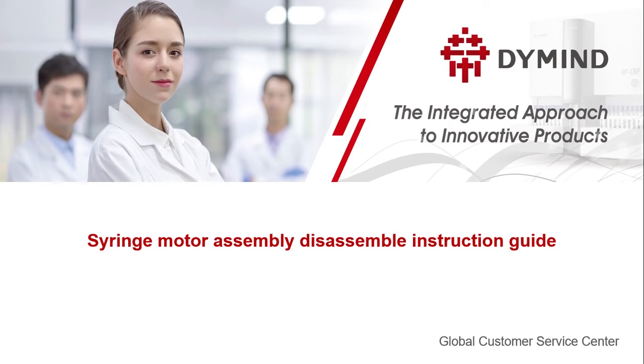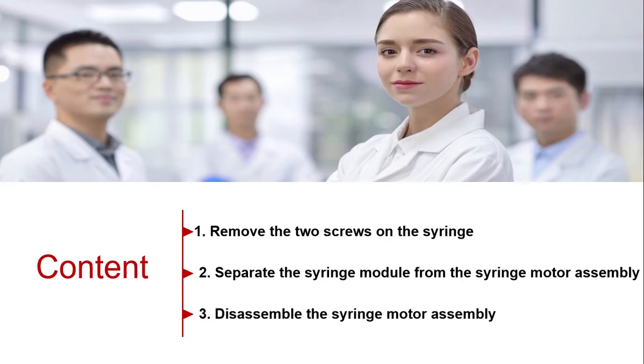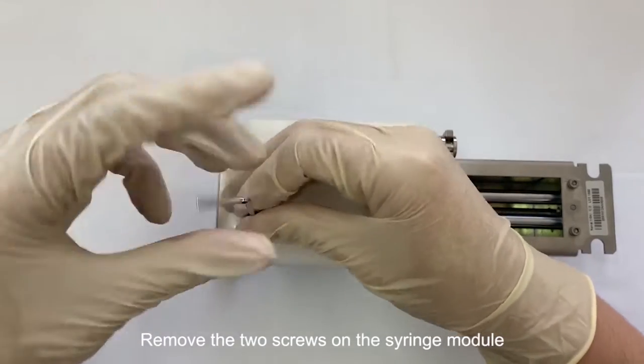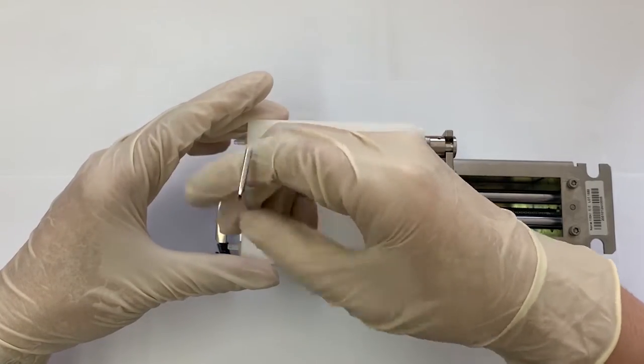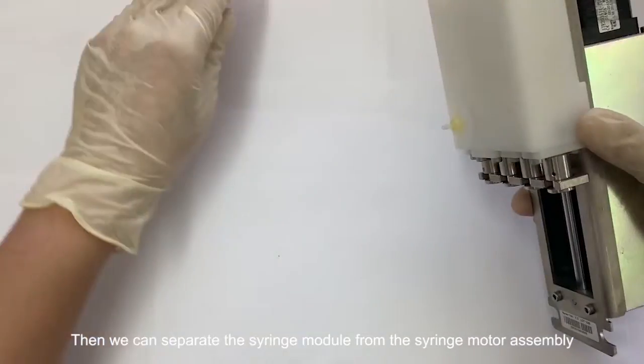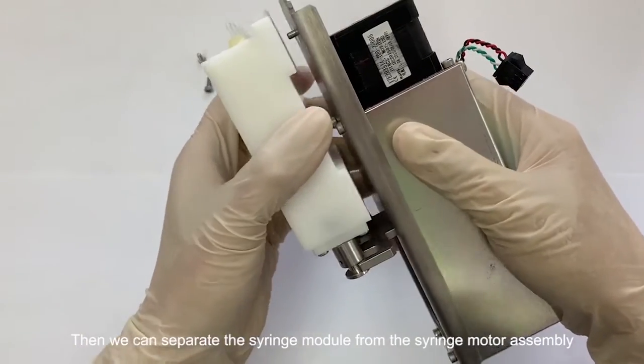This video shows how to disassemble the syringe motor module. Remove the two screws on the syringe module. Then we can separate the syringe module from the syringe motor assembly.